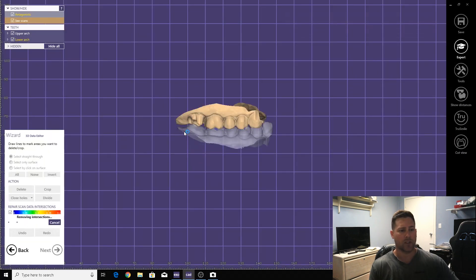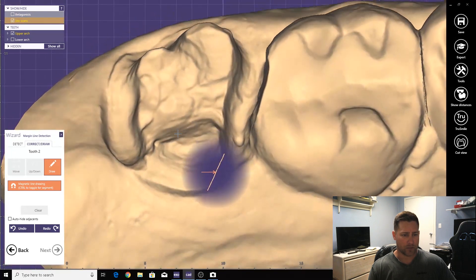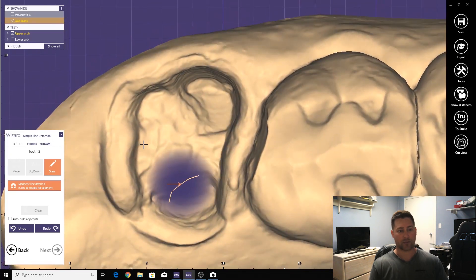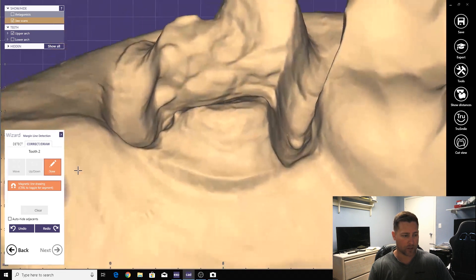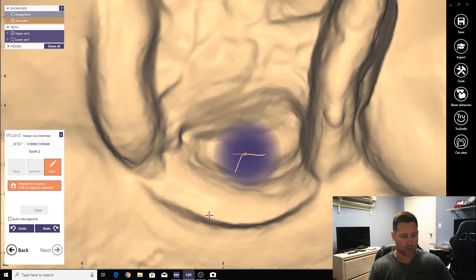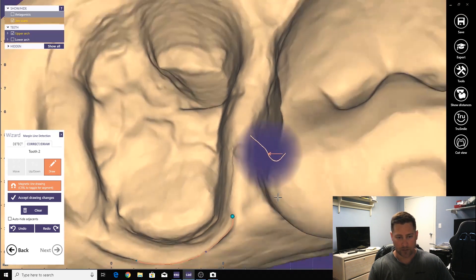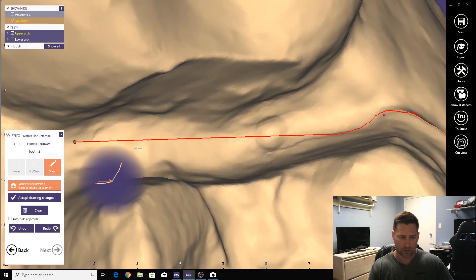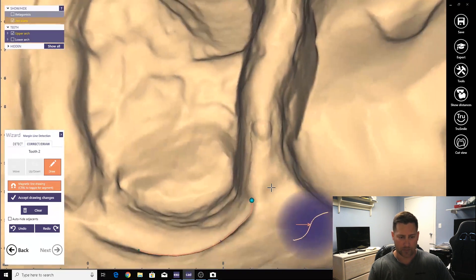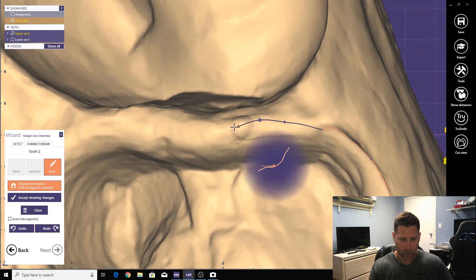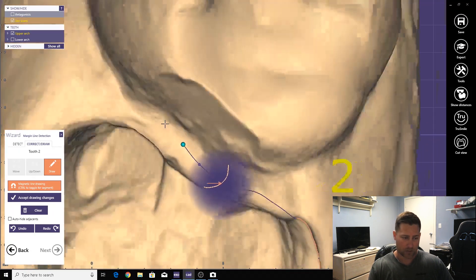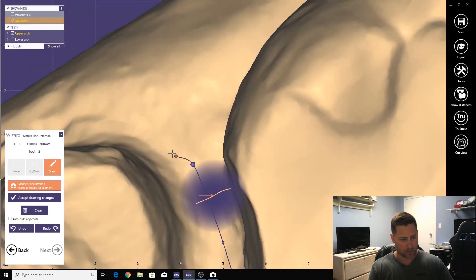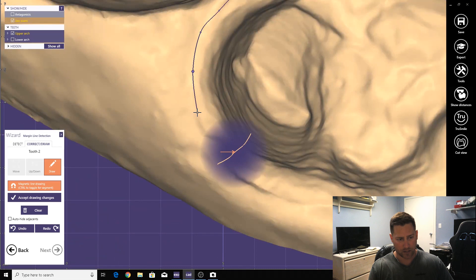Here we go. Now you're going to mark the margin, and this is where you can see it's still lacking in some areas — especially with intraoral scanners. If you've been doing it for a while you can see where the margins are, but it's tough. You're making an estimated guess. On this one, you can kind of see where iTero marked the margin right over here and we'll follow that guide. This is probably a case I would send back and have them re-scan — the margin is a little tough to see. We'll come back over here, get everything going, and make any adjustments needed.